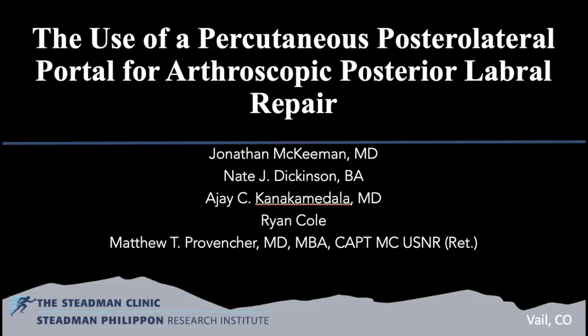Following is a demonstration of our technique for the use of a percutaneous posterolateral portal used for arthroscopic repair of a shoulder posterior labral tear.